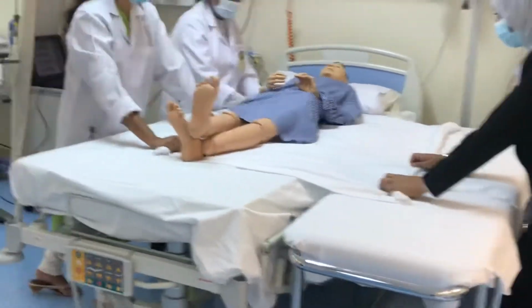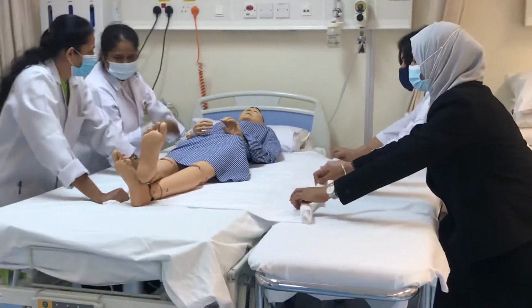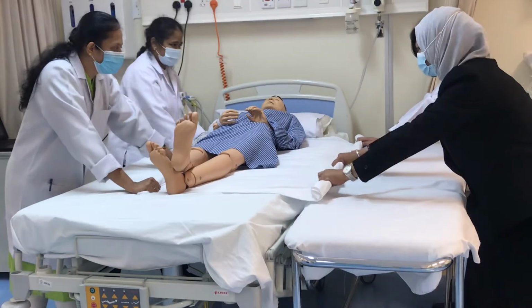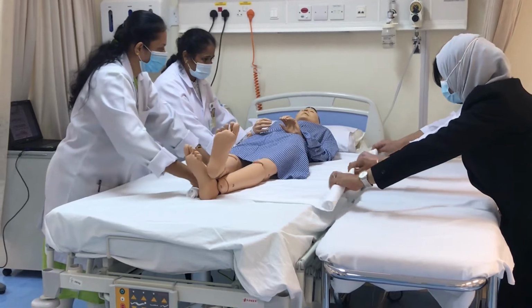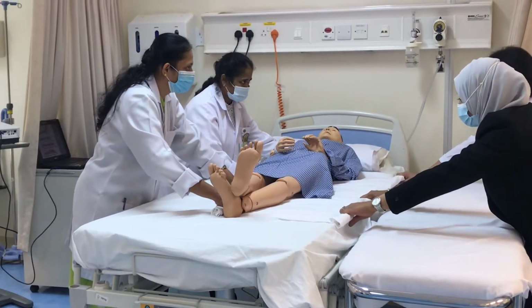Okay? One foot forward, the same process. On the opposite side, one foot forward. And then fold the turn sheet as near to the patient as possible. And then at the count of 1, 2, 3, we're going to pull this turn sheet to our side.